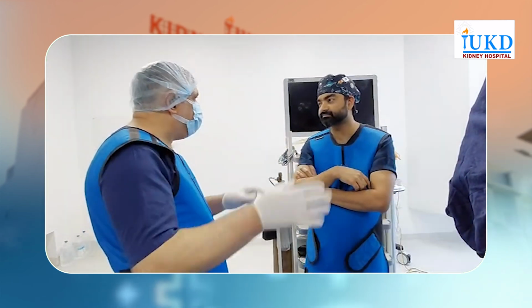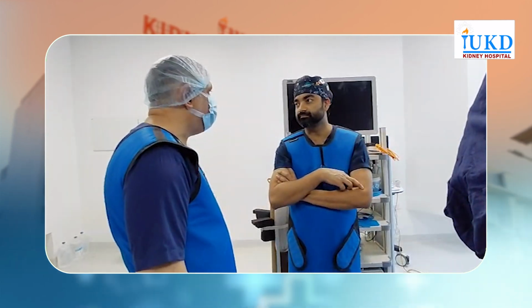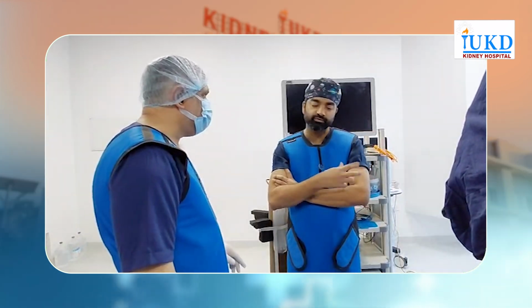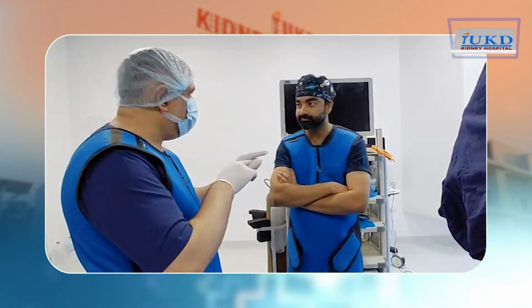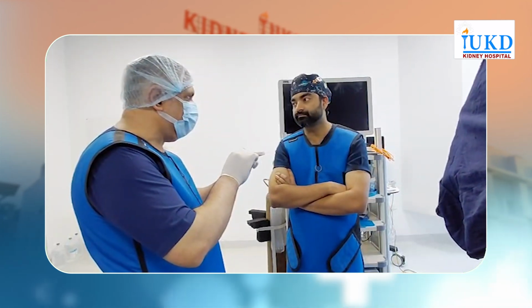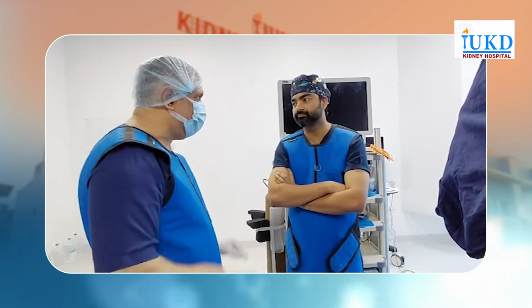If you already have patients with a full stone, full of stone, stagnant, you can do without contrast. Okay. Without contrast, but if you have contrast, you go back a little to push the guide.